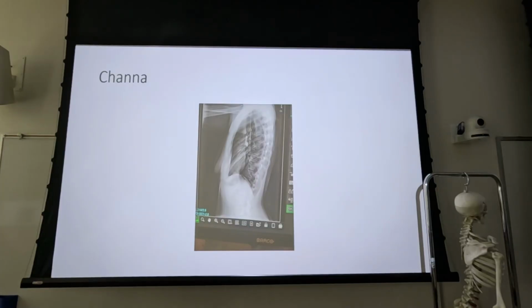What do you say? Who says good? Who says not good? Okay. All right, so walking through it, we've got some pretty significant rotation. The arms are straight out in front of the patient. And is there any reason to be pretty much right at the iliac crest with your collimated field? The answer is no, it is not.